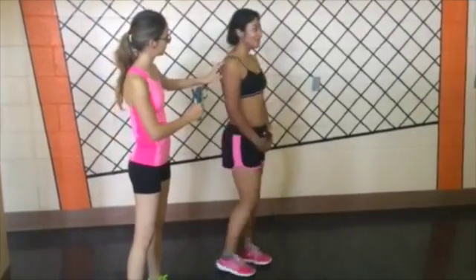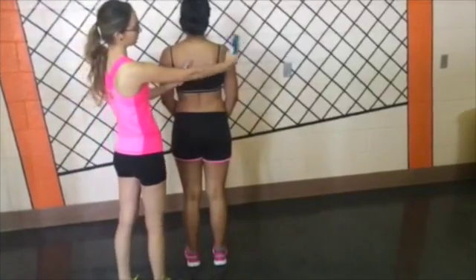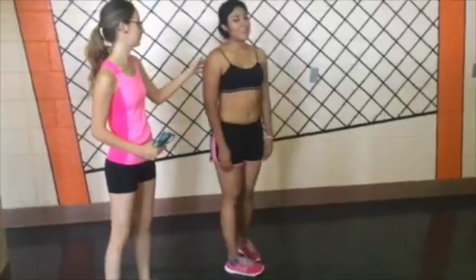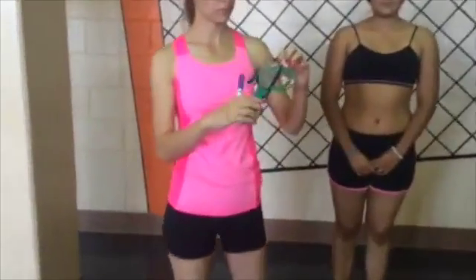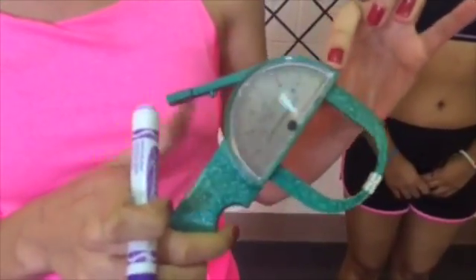To take skinfold measurements, the patient should be wearing just shorts for men, and for women a sports bra or tank top. Make sure to take the measurements on the right side of the body. We will use a caliper to take the measurements in millimeters. Make sure it's calibrated before using it.